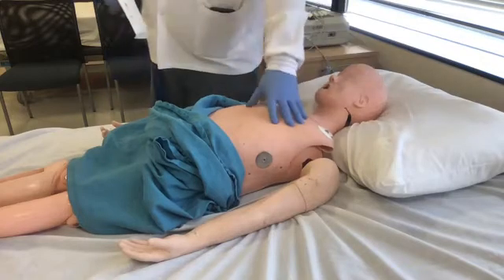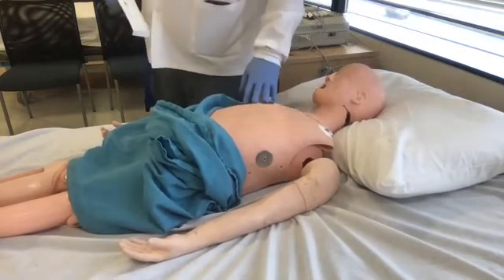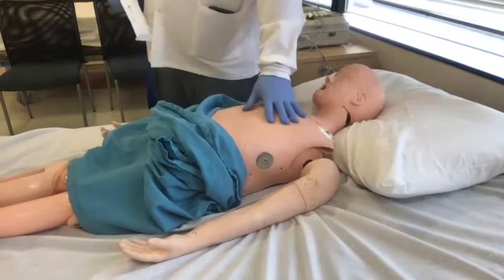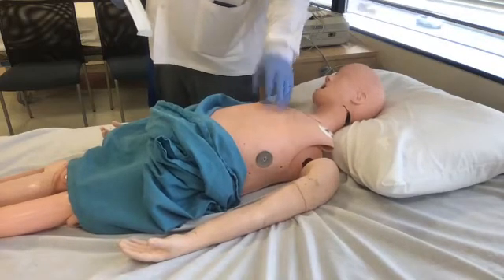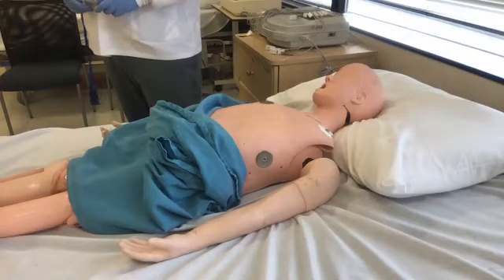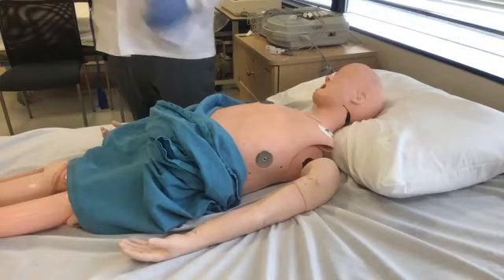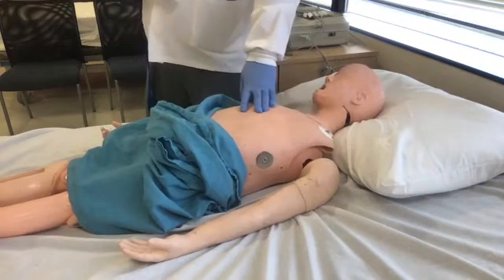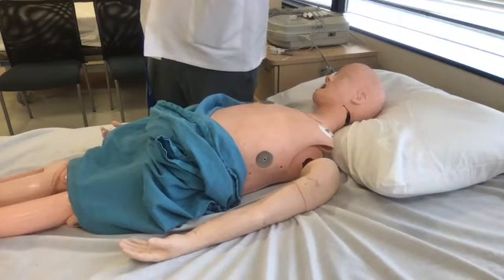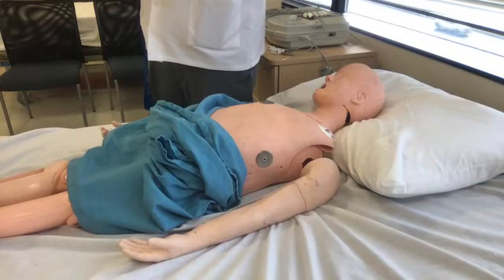Now, our boy, Mr. Marquez here, right? He's smooth. What if you got a bear on your hands, right? Yeah. Now, the textbook says you can cut, you can shave. Do not do that. About 4 or 5 years ago, I had a student who thought, hey, let me start shaving my patient. Please. And you know what? In her defense, yes, it was in the textbook. But in my defense, in my lecture, I say, don't do it, please. Right?